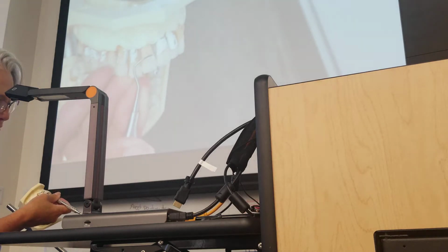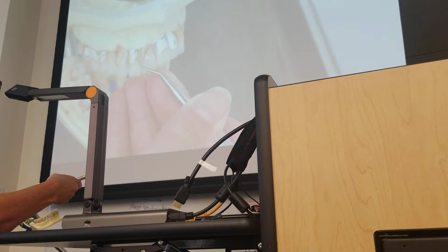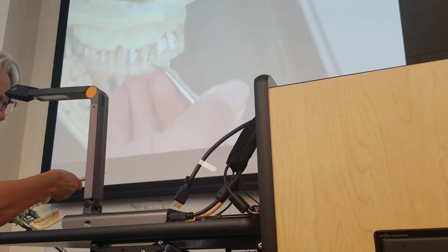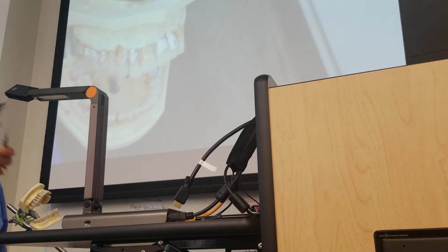So I'm going to insert it as close to 0 as I can get it. I'm going to open it up to the correct angulation. You're starting at the midline? I'm going to start just on the other side of the midline, like we did with the Explorer.